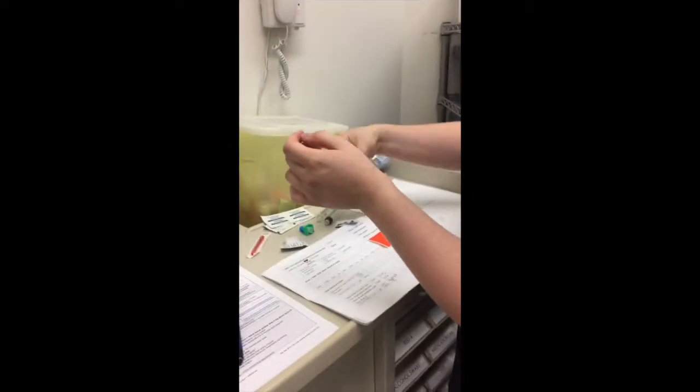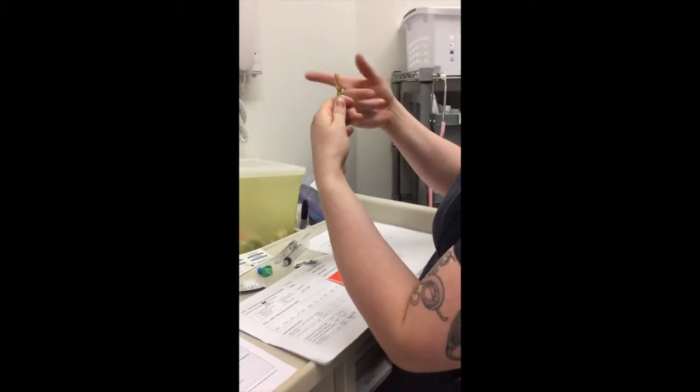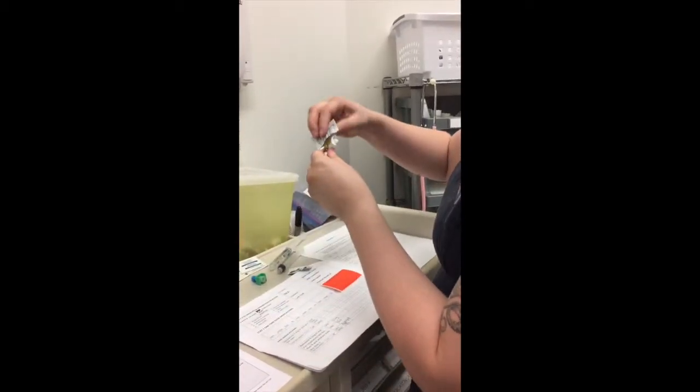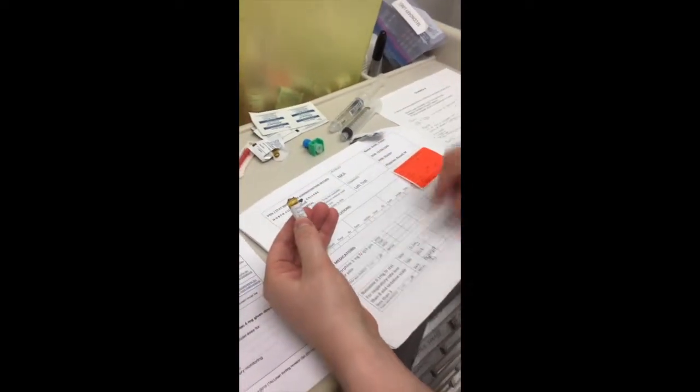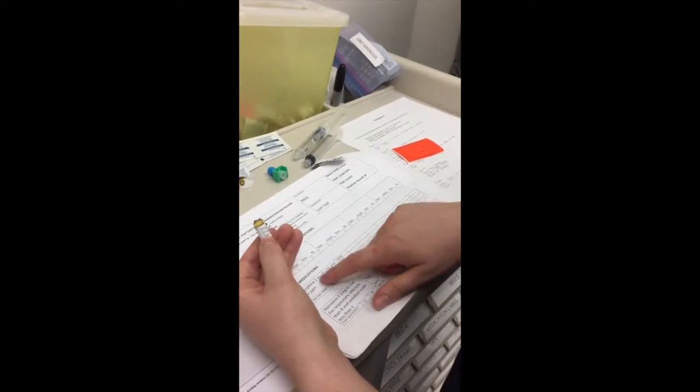All the morphine out of the top here. Break it off. Since when I took it out I made sure I matched, so morphine, my math, I know I'm going to be taking out the entire thing to dilute it. It's for Evelyn Smith, and it's for pain, and it's going to be given now. And there's my documentation, every 1 hour, IV, and morphine. So I've got that ready.